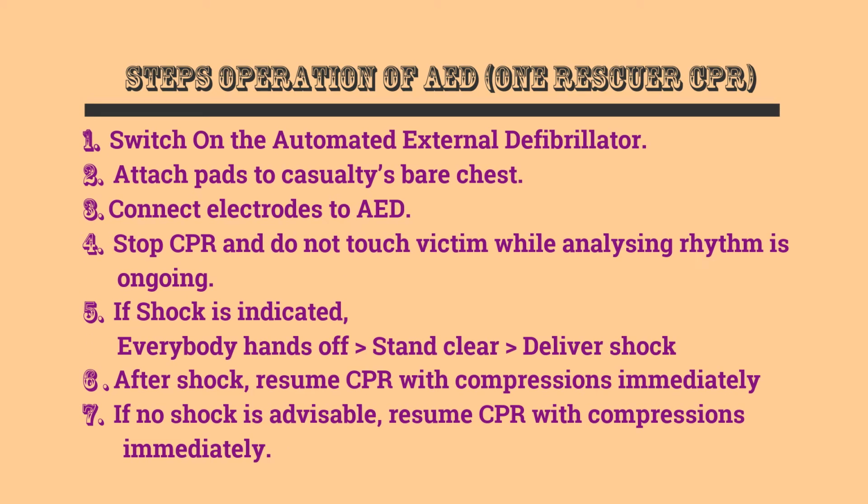Please follow the instructions given by the AED. First and foremost, switch on the AED. Next, attach pads to the casualty's bare chest according to the manual. After that, connect the electrodes to the AED. Stop CPR and do not touch the victim while rhythm analysis is ongoing.